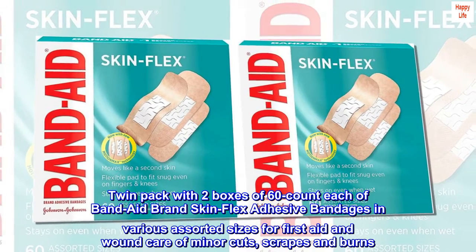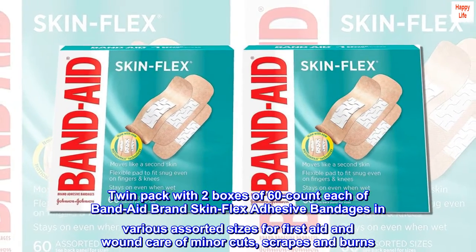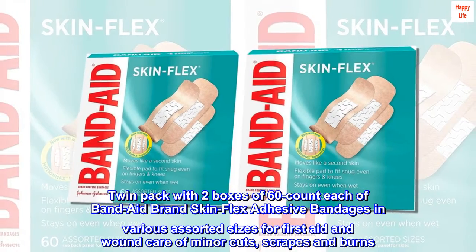Twin pack with two boxes of 60 count each of Band-Aid brand skin flex adhesive bandages in various assorted sizes, for first aid and wound care of minor cuts, scrapes and burns.